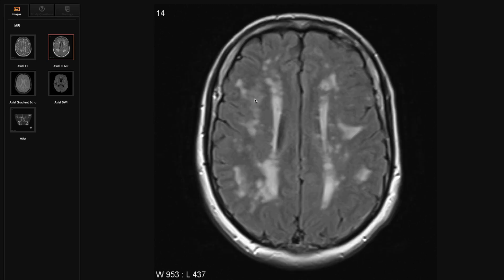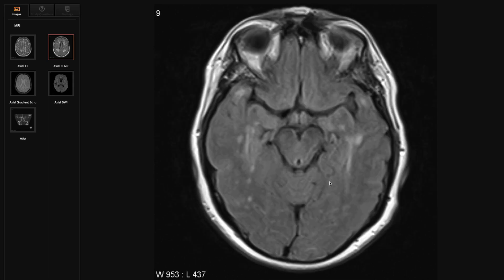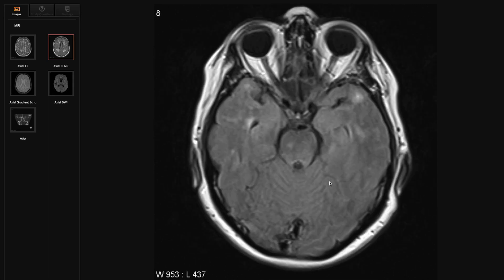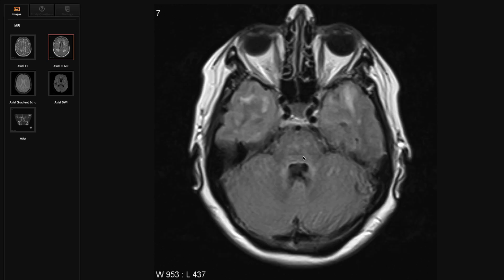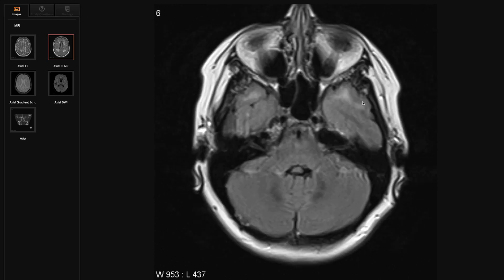We've got that symmetrical but random distribution — both frontal lobes, both parietal. But importantly, the temporal lobes are really quite badly affected, especially the subcortical white matter. And that's a characteristic feature of CADASIL.